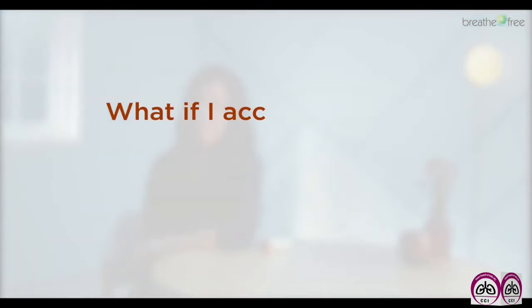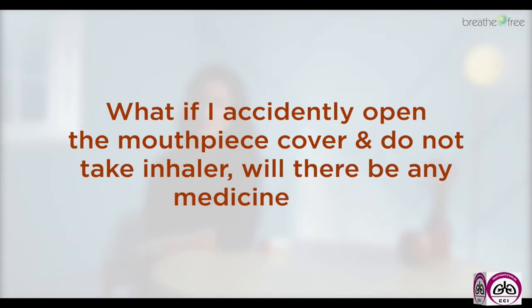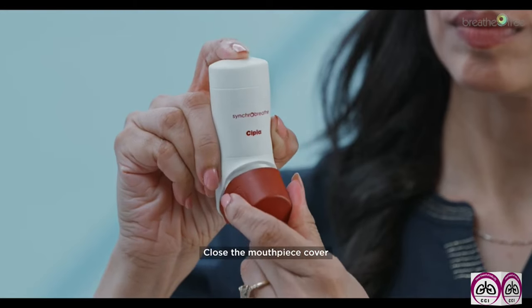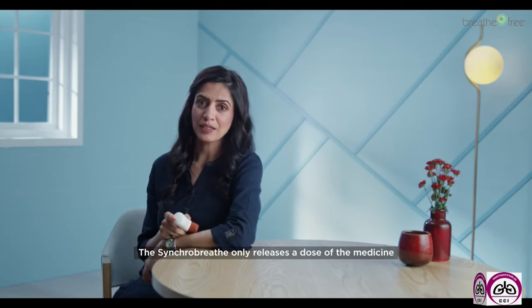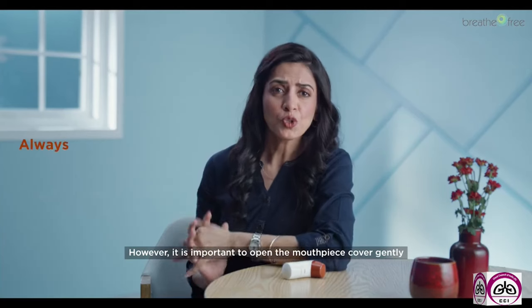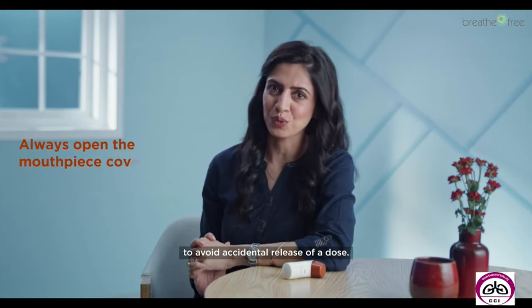What if I accidentally open the mouthpiece cover and do not take inhaler? Will there be any medicine loss? Don't worry. If you accidentally open the inhaler, there'll be no medicine loss. Just close the mouthpiece cover immediately. The SynchroBreathe only releases a dose of medicine when you place the mouthpiece in your mouth and inhale through it. However, it is important to open the mouthpiece cover gently to avoid accidental release of a dose.